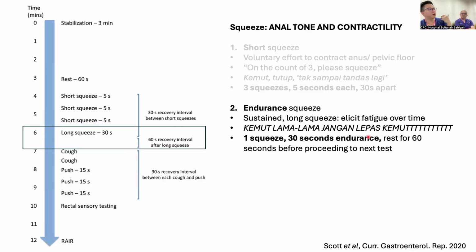It is also more comfortable for the patient, considering that this will be a procedure that's done over 20 to 30 minutes. I also consider that the manometry system itself, the instrument itself, is a tube. It can very well come out. We don't have a balloon that anchors it in position. So if we were to perform the entire test in the sitting position, the probe may actually fall out.